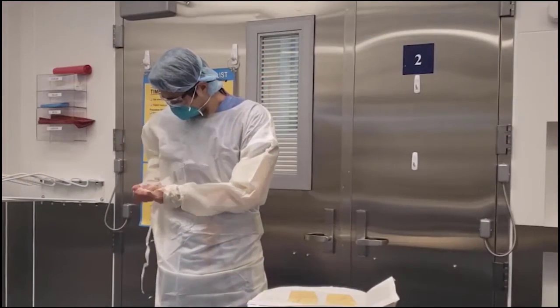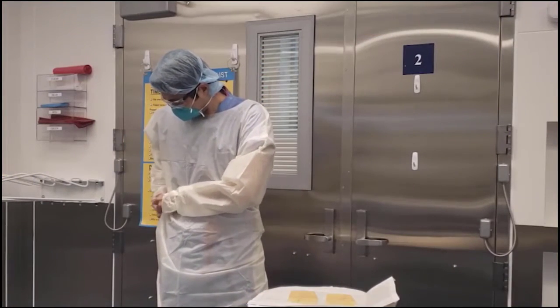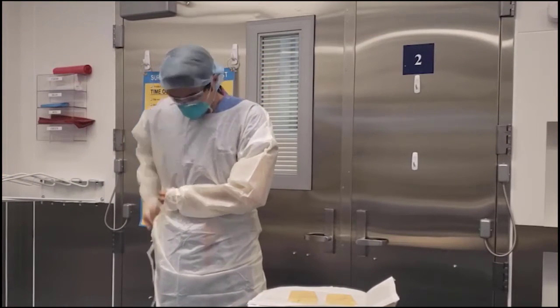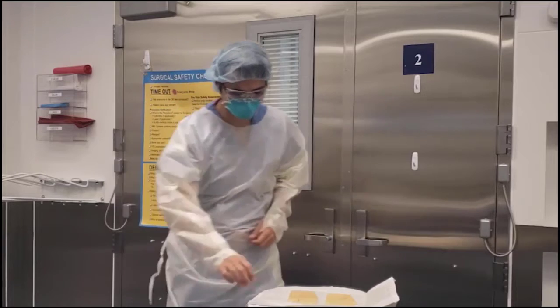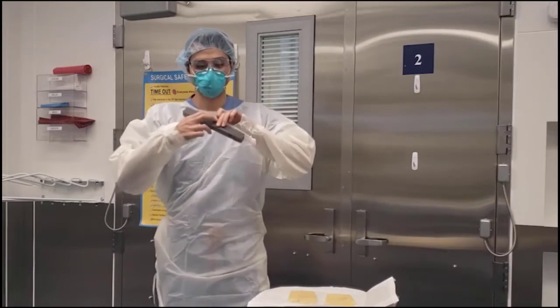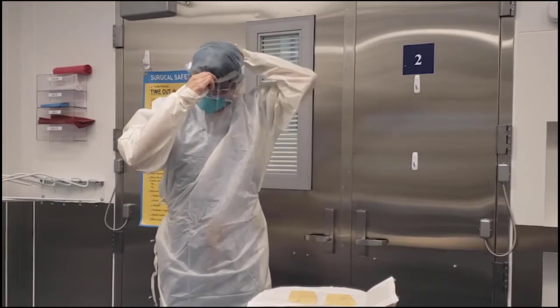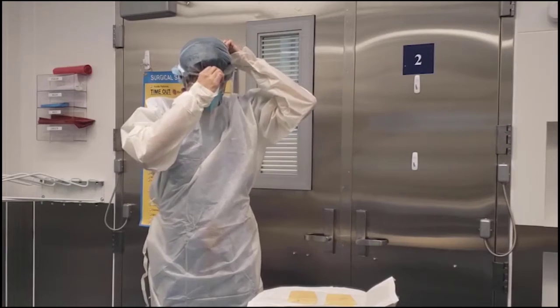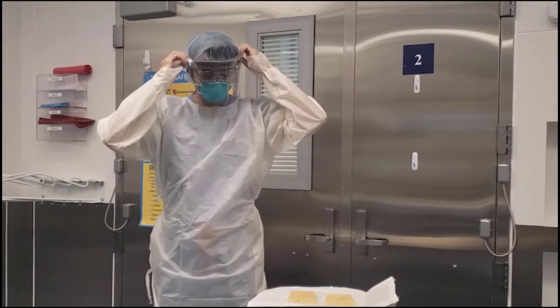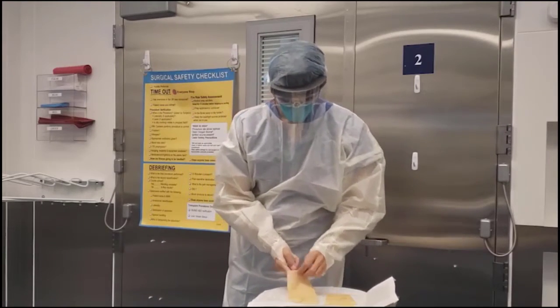Percutaneous tracheostomy is considered to be an aerosol-generating procedure. All persons in the room must be wearing PPE. Your institution's policies regarding the use of appropriate PPE during aerosol-generating procedures should be followed.